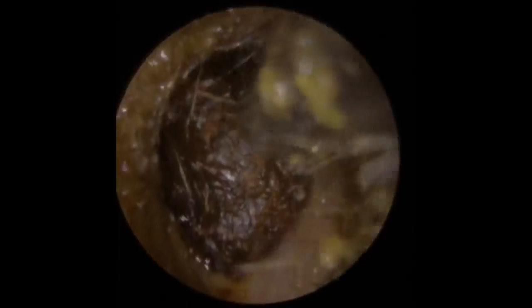You can see now we're coming towards the outside edge, still moving forwards — a little bit broke away there. You can see it's a fine line to tread as far as maintaining the suction grip but also trying not to break too many pieces off. Ideally you want to try and keep this as one big piece if we can. Just see a bit of movement to the top portion of the wax — that's come away now, there's more behind it, and that should give us a little bit more wiggle room. You can see where this wax has started to dry out a little bit — we've got a grip, now it's starting to move. We've got a good grip in the centre, trying to aim for the same spot — that's the goldilocks zone of this wax.